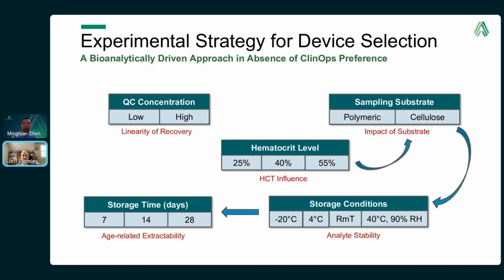Now, if the reduced temperature QCs have a higher response than those freshly prepared and dried 24 hours at room temperature, then we know right away we have an initial degradation of analyte upon drying. In that case, we will store our freshly prepared QCs at reduced temperature for 24 hours or more for an accurate assessment.